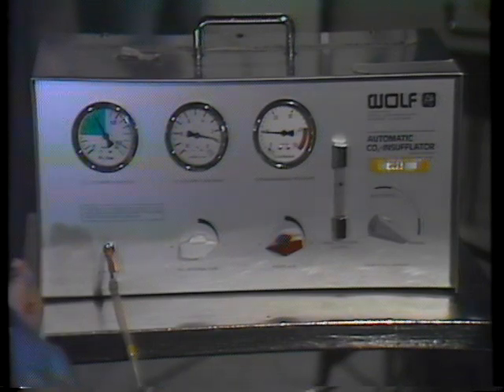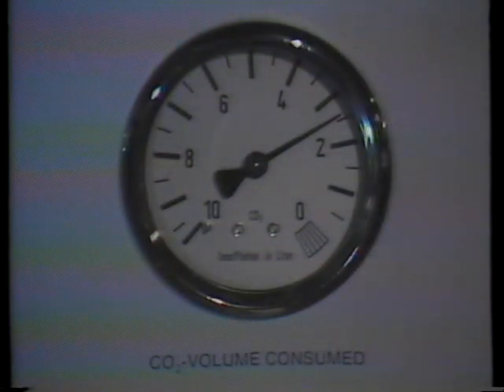This takes a few minutes. If you are awake, you may experience fullness in your abdomen at this time. This lasts only a short period of time.